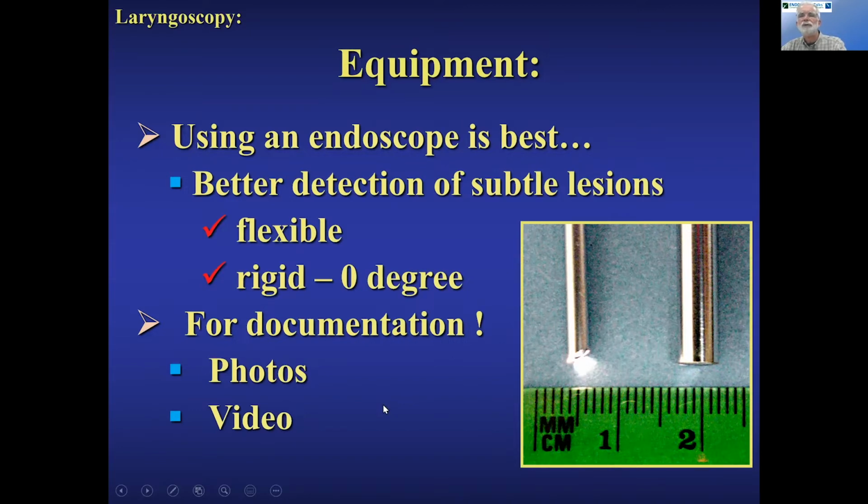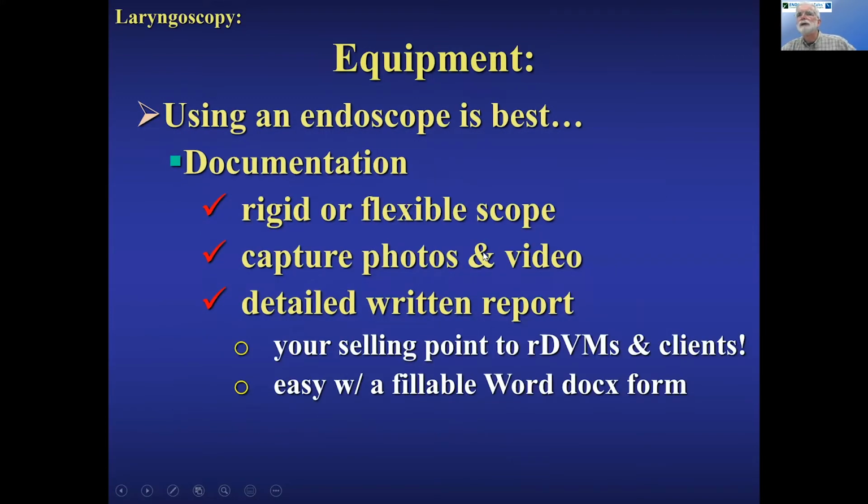And very, very critical, important things are to document it by photos and ideally video. That requires a little bit more equipment, but you can hook it up or at least videotape that somehow to be able to see what's going on. For those in practice, I've spent 13, 14 years in two different specialty referral practices, big ones, and they had a detailed written report. This is my selling point to the referring veterinarian and to the client.